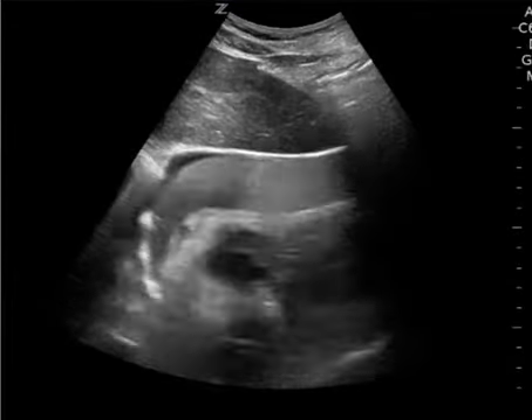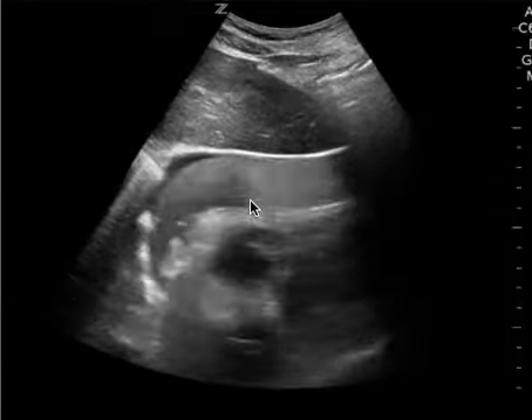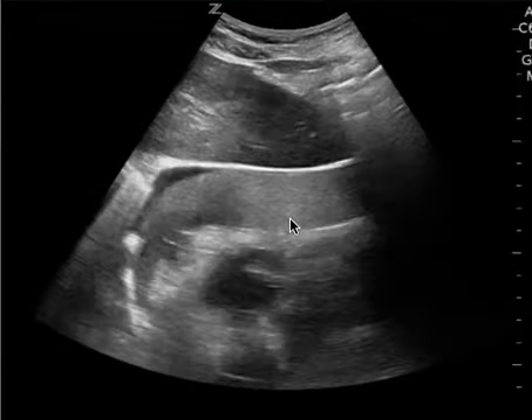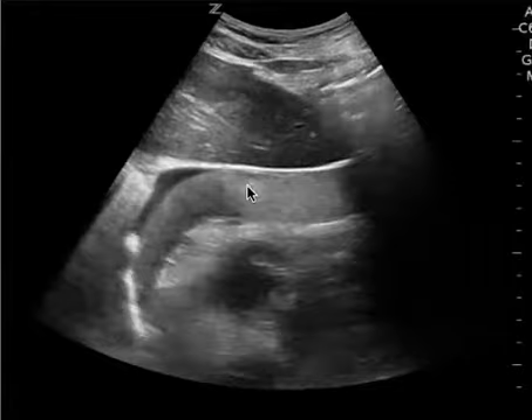This is a cardiac ultrasound and there is a clear pericardial effusion. I wanted to show this video not to illustrate that there's a pericardial effusion, since you saw that at the bedside, but to illustrate why a pericardiocentesis probably is not going to work in this patient.